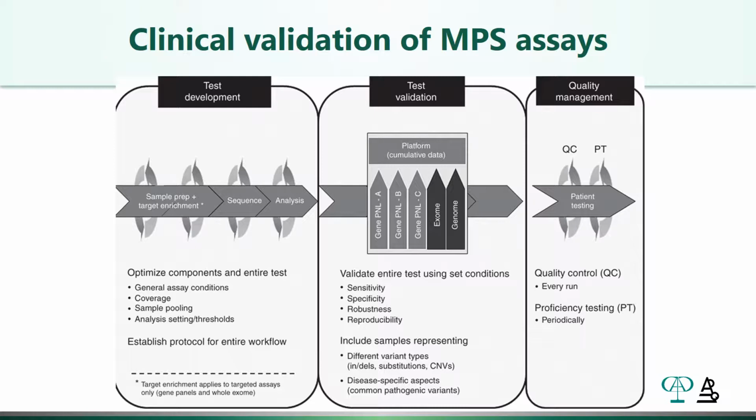And then, of course, as for all clinical assays, there's ongoing management and quality improvement, which includes making sure that you have external quality assurance assays that you're doing regularly in the laboratory to make sure that your platform is performing as you think it should.